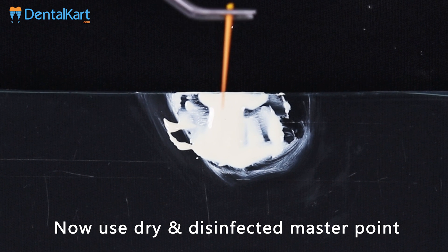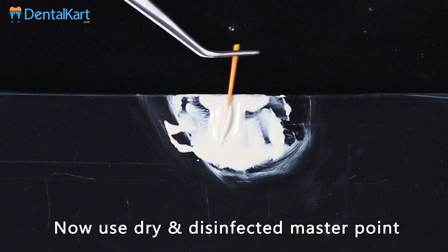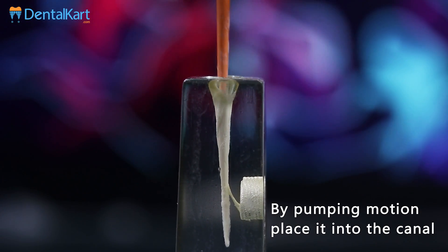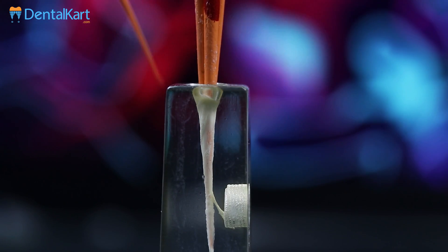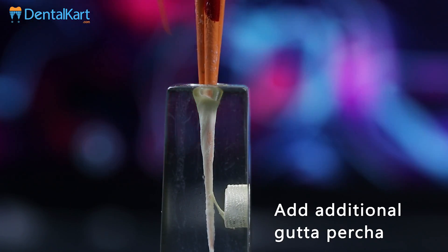Now dip the disinfected and dry master point into the Sealpex, and with a pumping motion slowly push it into the canal. Additional gutta-percha points and lateral or vertical condensation methods can be applied.